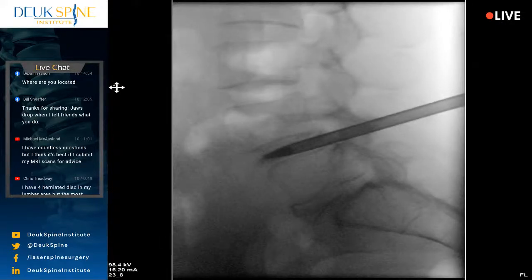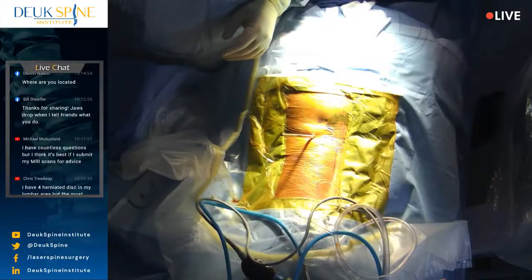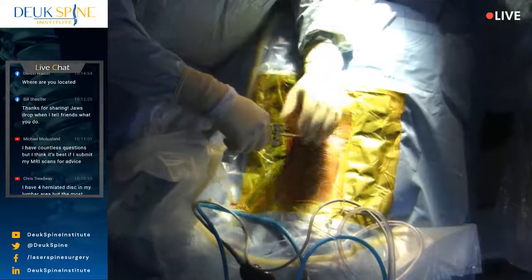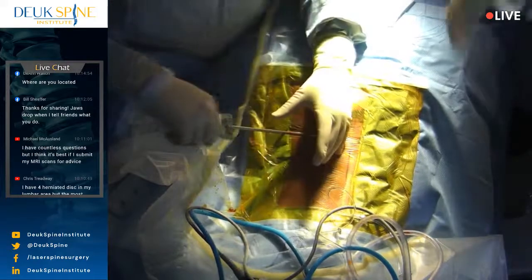All right, I'm not sure where the tube tip is again, but let's pull back on the dilator and see. I'm going to show you what we use here so you can get a better understanding of what the dilator is. I think the tube's in. Yeah, we're in.